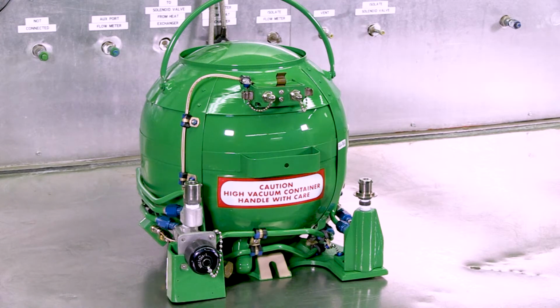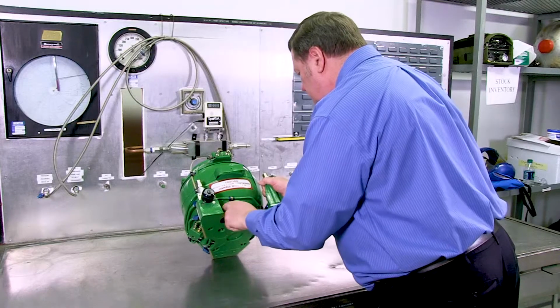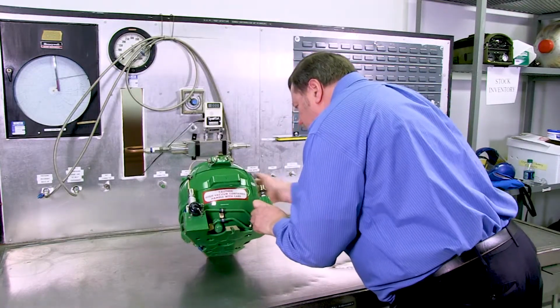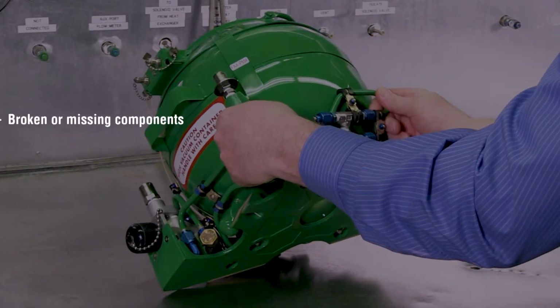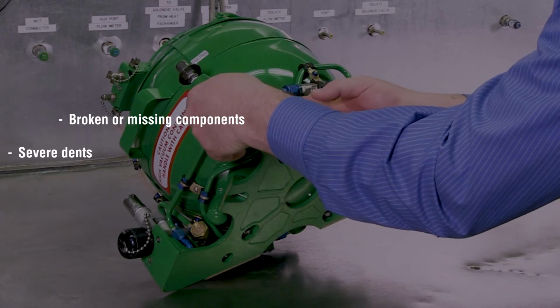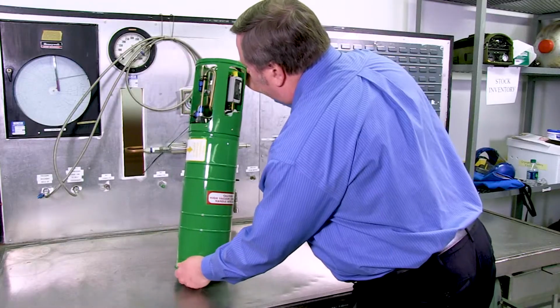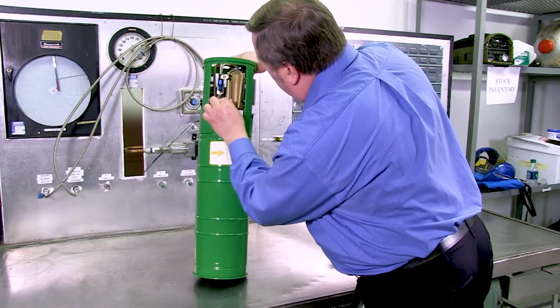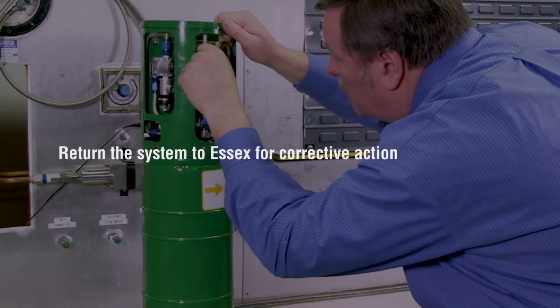It is recommended to complete a general inspection on LOX converter units at least once a month. When performing general inspections, check the converter for any damage that could possibly affect the system performance, such as broken or missing components, severe dents, or missing fasteners. If any condition exists from the inspection that makes the system unable to perform its intended function, return the system to Essex for corrective action.